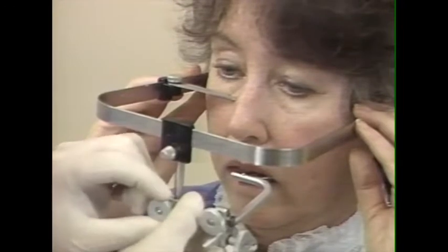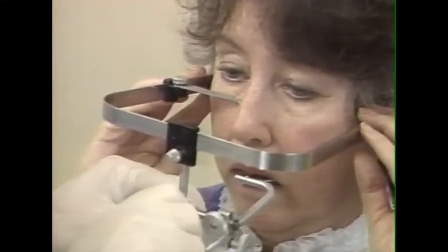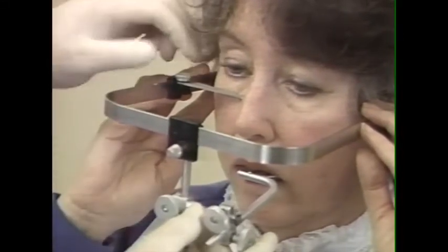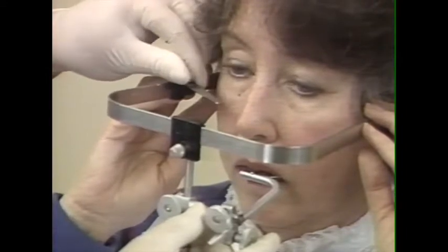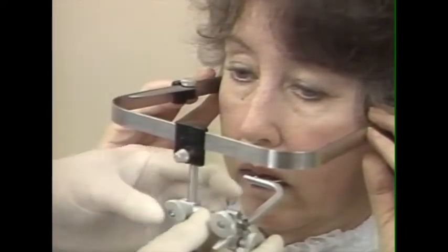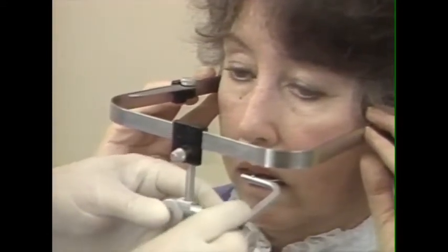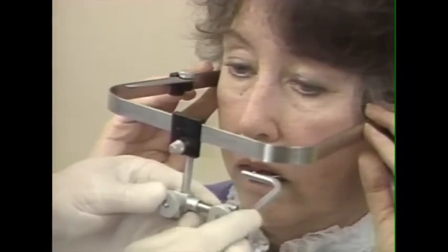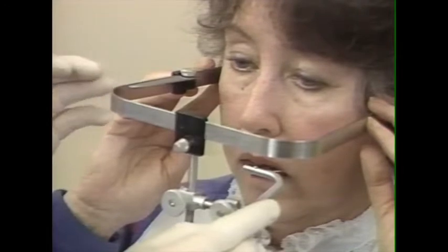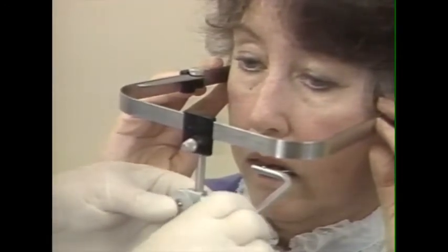We then need to tighten this number 1 screw at the proper level. Tighten it securely so that it won't slip. We're now finished with the infraorbital pointer, and we can move it back out of the way. We next want to be sure that the face bow is not in a bind and it's perfectly free. It can be pushed too far to one side so that we will not secure a correct record.